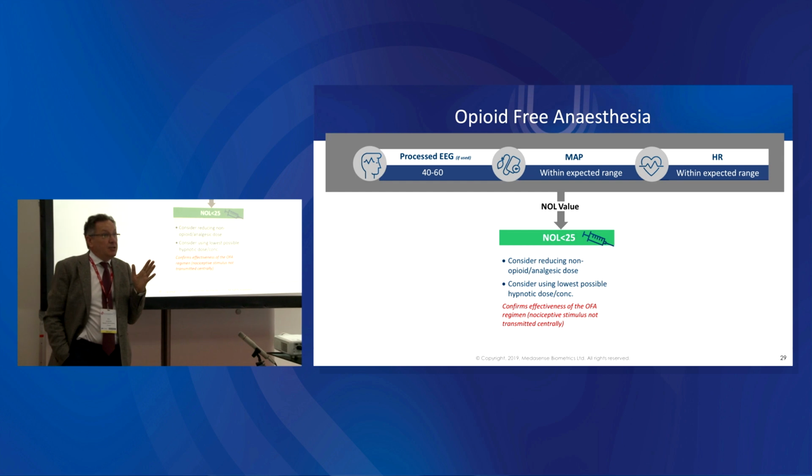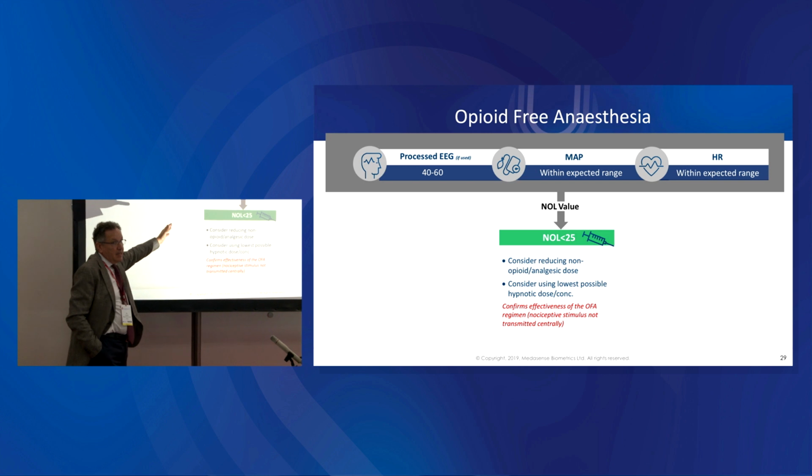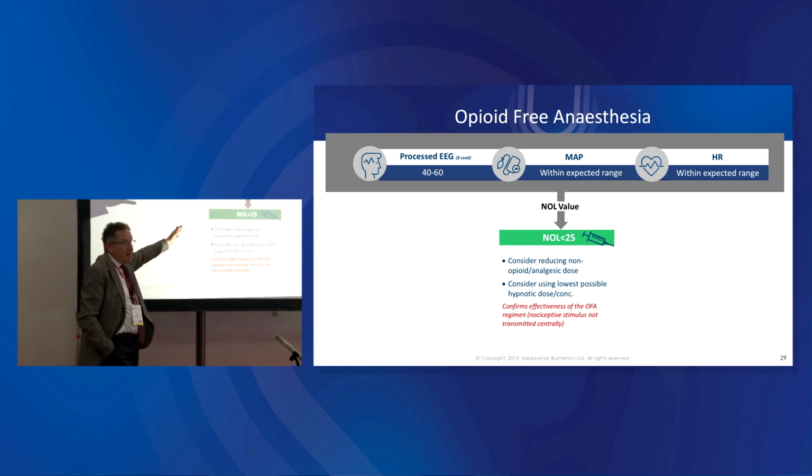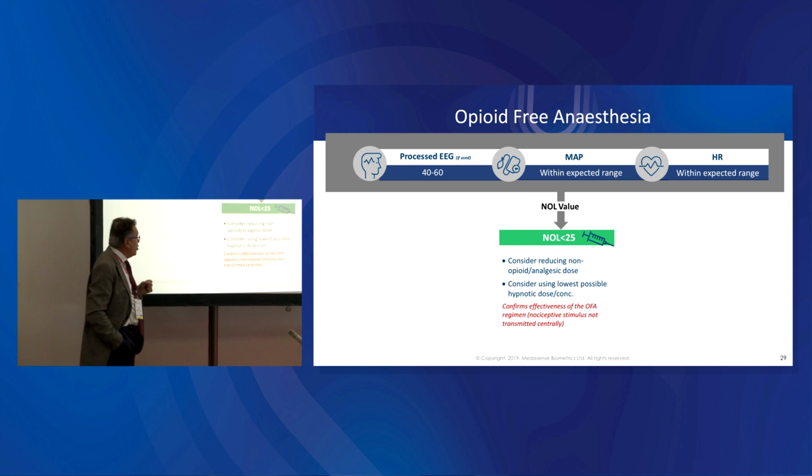And in this case, you don't know where you are, especially if you're using dexmedetomidine, which will actually obliterate eventually the heart rate response. And in this case, I would say that with opioid-free anesthesia, the requirement for monitoring is even more important than with the classical opioid-hypnotic.